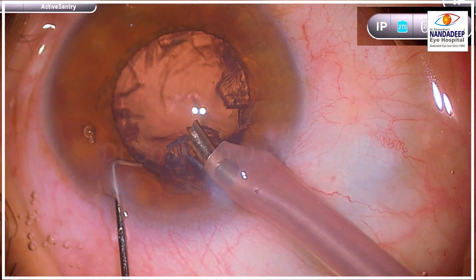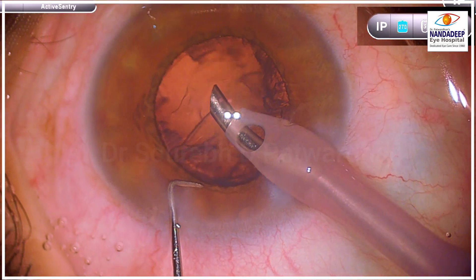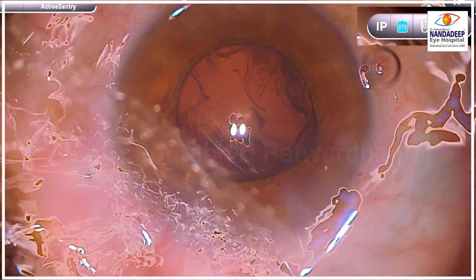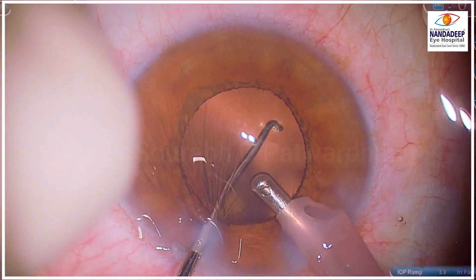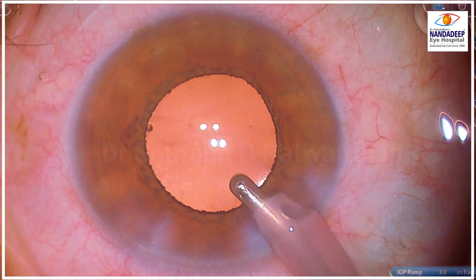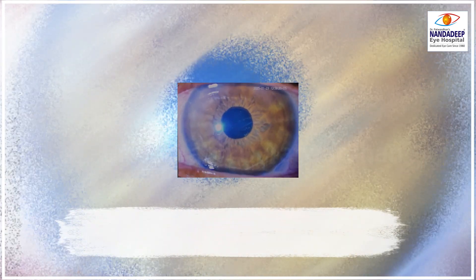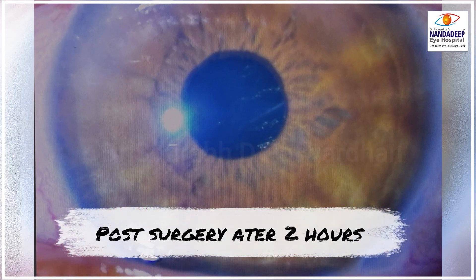I have been using this technique for grades from 0 to 3. I try to utilize this technique if I get a good CCC and I could prolapse one pole of the nucleus out. And how does this affect the endothelium? You can see the post-surgery picture just two hours after the surgery — and this is what I see in all my patients. These patients are quite happy with their immediate post-operative vision as well.